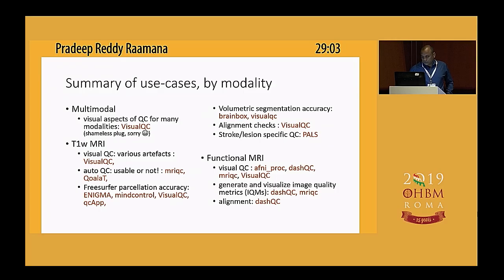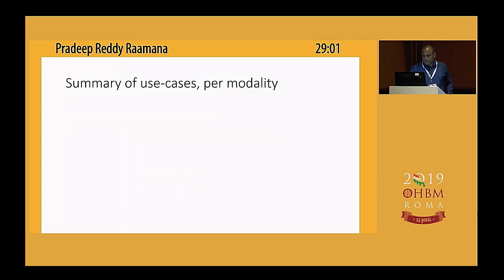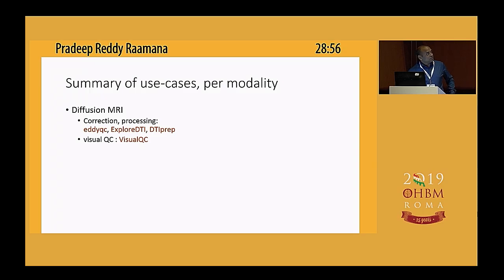And for diffusion MRI, as you have just heard from Professor Leemans, ExploreDTI is a great tool. There's also a tool from FSL called eddy QC, which is a bit more batch processing oriented and can help with single subject as well as group dataset QC.